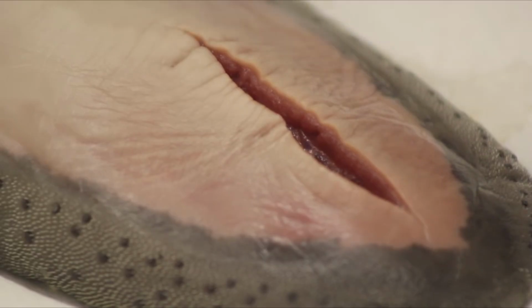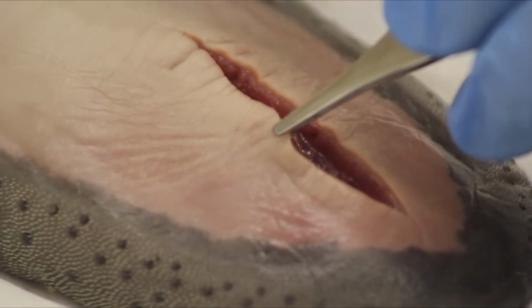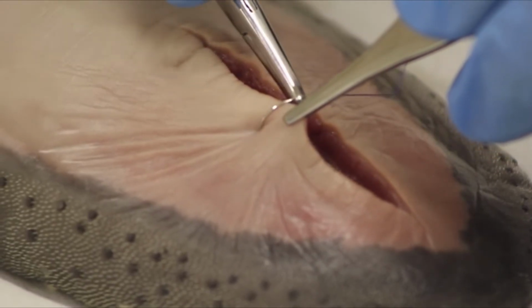Load the needle securely, typically about 2/3 of the way from the tip toward the swage, so the needle follows its natural curve when it rotates through tissue. Evert the first wound edge with the forceps, then enter the skin at about 90 degrees.